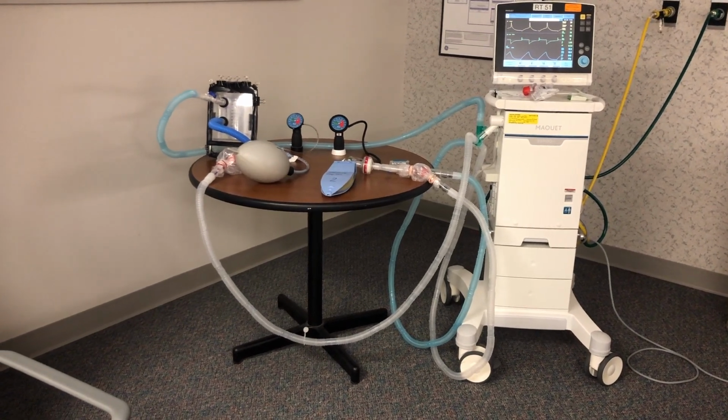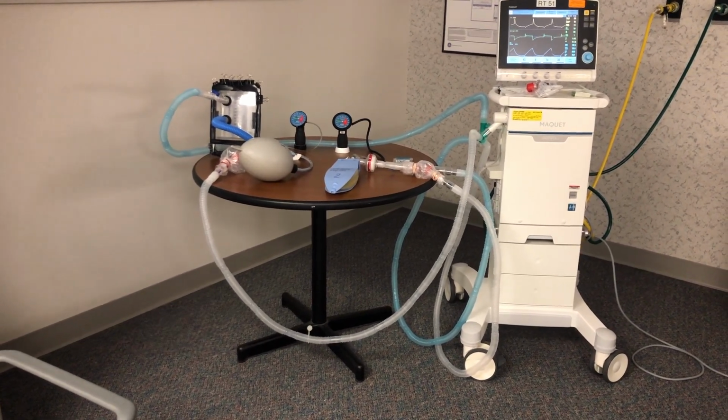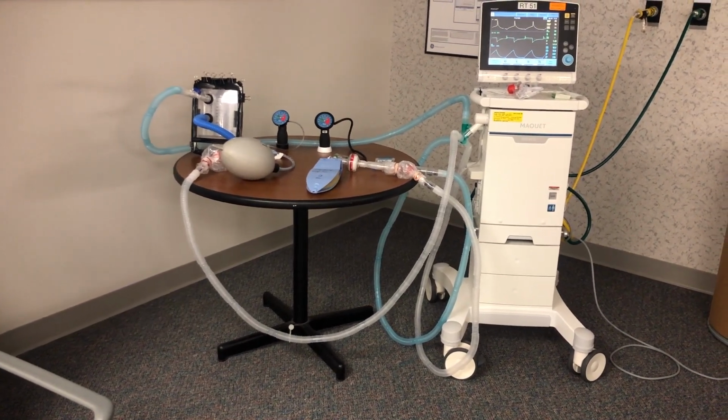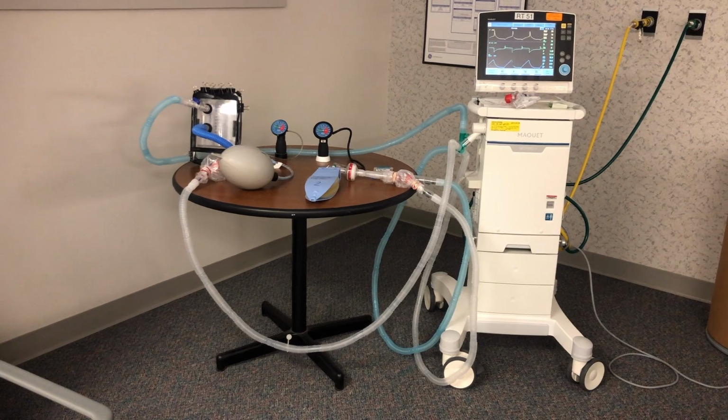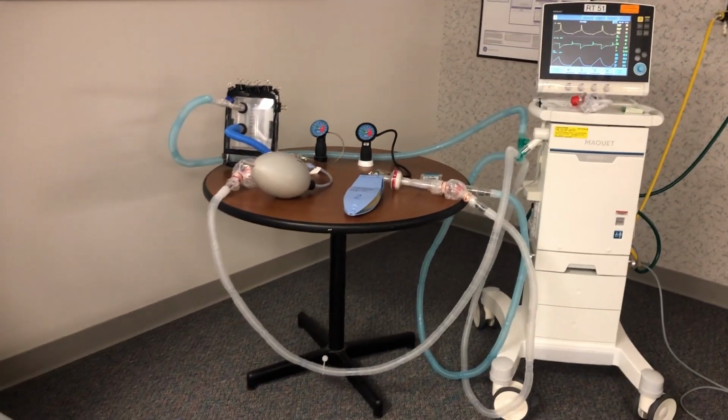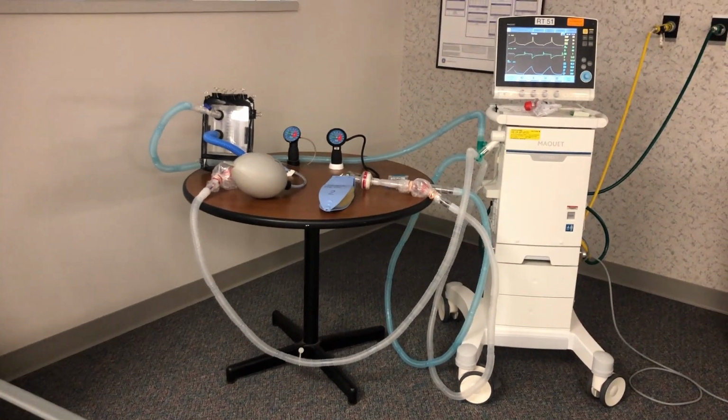Hopefully none of my colleagues has to use this setup. That is my wish, but we should also be prepared, and it is a very easy setup to make provided we do it the right way, and should do the trick.